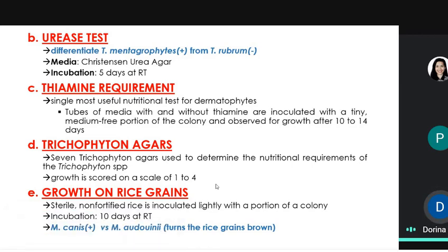Thank you. Ano yung pangalan ni Christine? Christian. Christine. Okay, it's just to differentiate your mentagrophyte again from your group. Paki-check ulit yung urease test with the molds. Hindi ko alam kung doon sa ano yata yung rapid urease test, magkulay pink siya or pareho lang sila. Anyway, just go over your module.